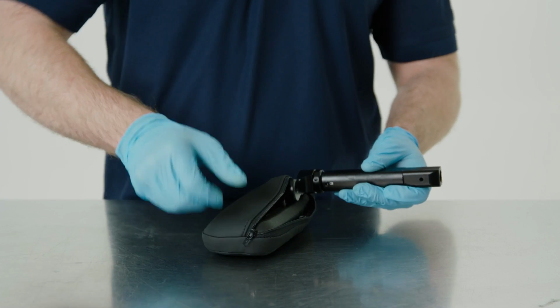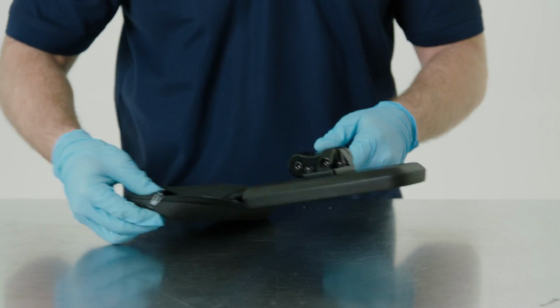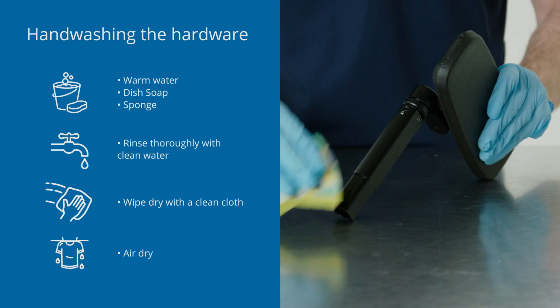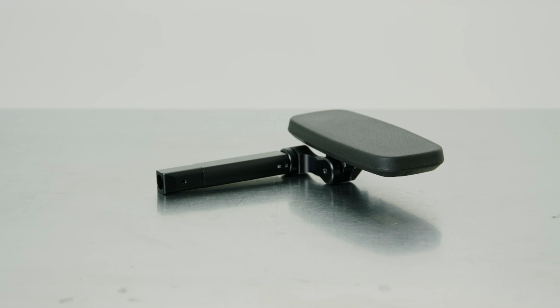Bodilink accessories and comfort accessories are simple to clean and disinfect. For all accessories, separate the cover and inserts from the hardware. To clean the hardware, hand wash using warm water with soap and a sponge. Rinse with clean water and wipe dry with a clean cloth before allowing to air dry completely.